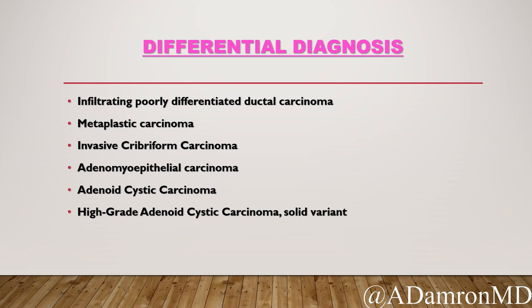Cribriform carcinoma typically presents as a lower-grade invasive tumor, so that may not fit this histology. Could it be an adenomyoepithelial carcinoma - something that arose from an adenomyopithelioma with malignant transformation of the myoepithelial or epithelial component? That's worth considering. Adenoid cystic carcinoma is something you should think about given that basement membrane-like material, but it's a little higher grade than we typically see. The solid variant could be considered, but even then, is the grade too high? The nuclei and high mitotic activity make you wonder if it truly fits that category.